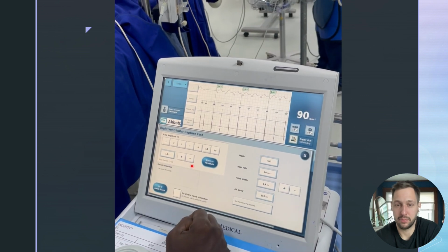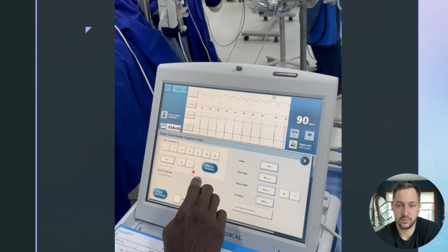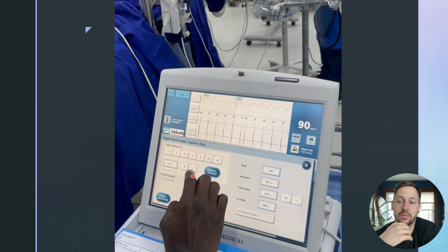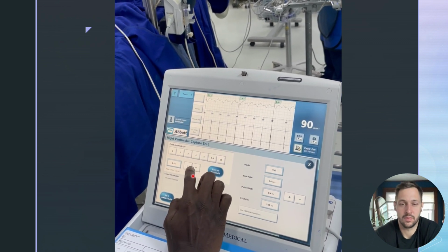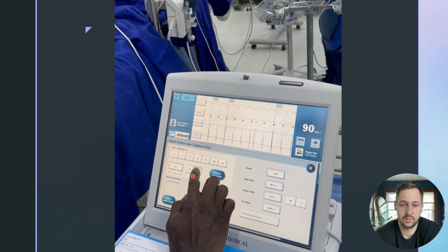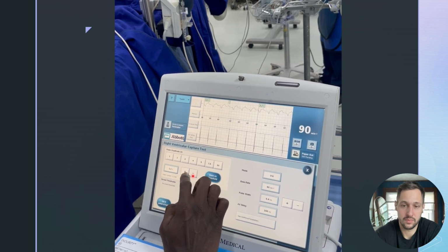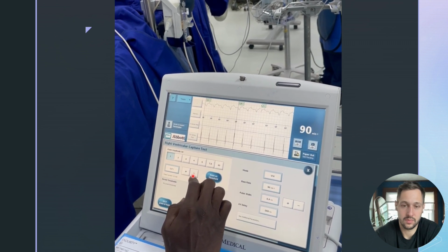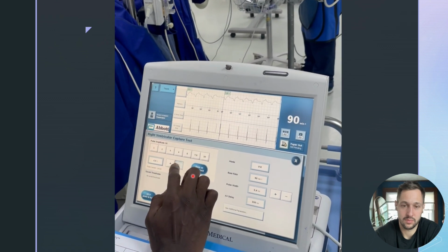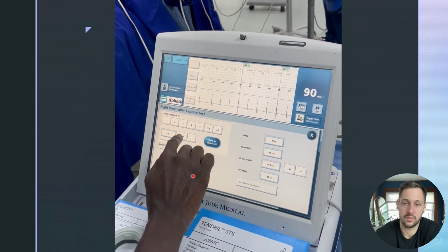These allow you to come down by decimal points. 1.8, 1.7, 1.6, 1.5, 1.4, 1.3, capturing still, 1.2, 1.1, 1, still capturing, 0.9, 0.8. I lost at 0.8, so I'm saving at 1.